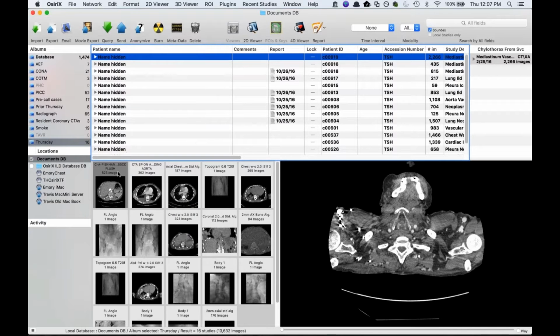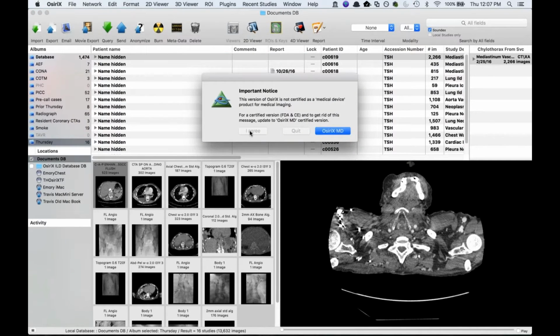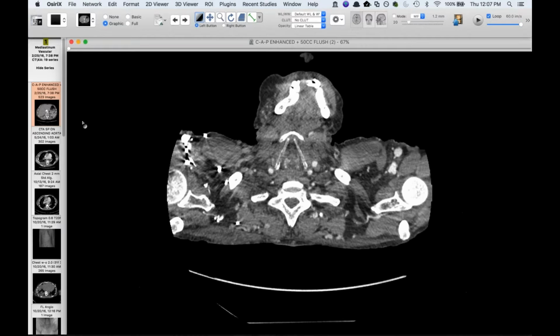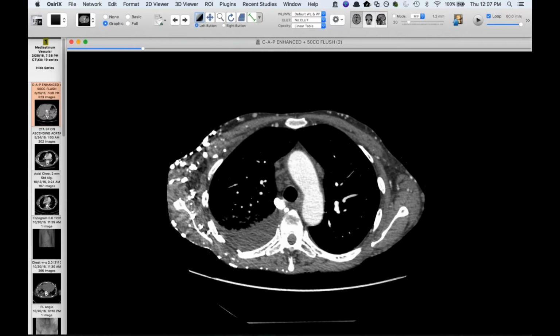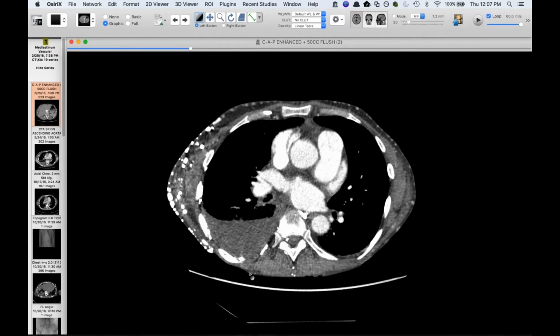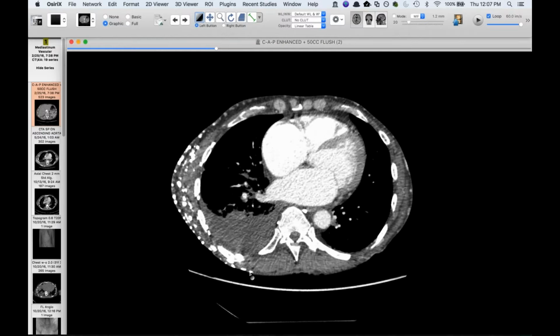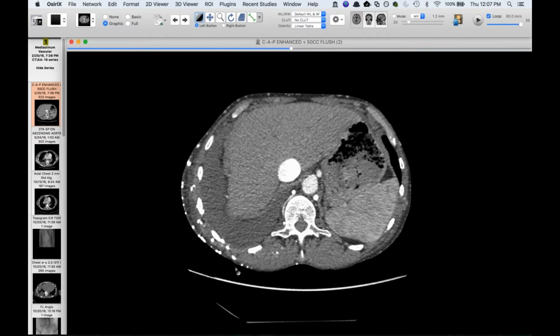Yep, we do, thanks. Now, this first case is a really cool case that I've seen in the past, and my fellow Kim just brought this to my attention this morning. I'm going to show you old CTs first, and you can see that this patient has an occluded superior vena cava and lots of collaterals in the chest wall. They have end-stage renal disease, and they have this right-sided effusion that's been chronic, and it was getting worse.